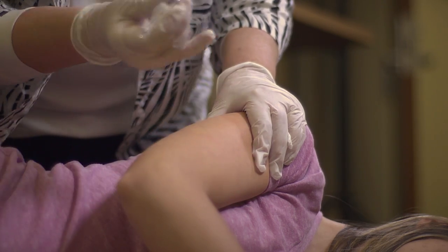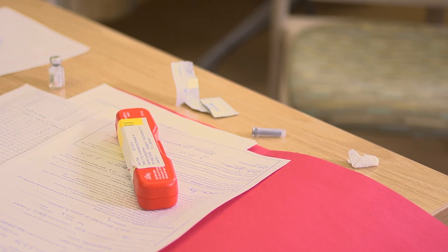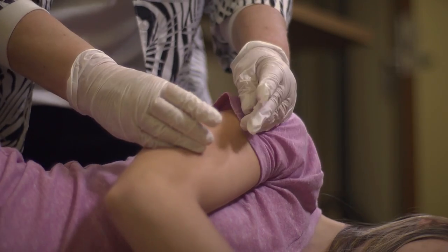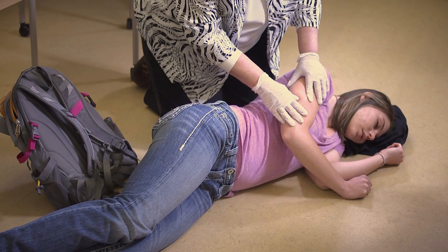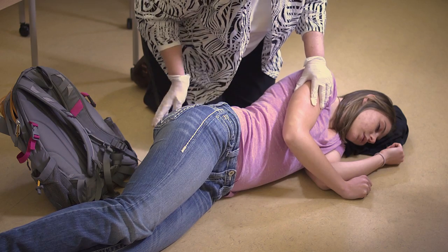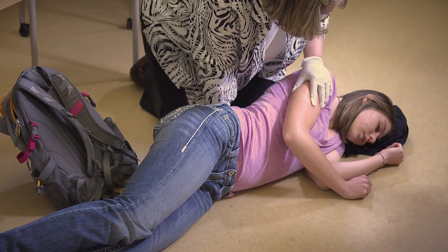Remove syringe. Put the used syringe in the carrying case. Close the carrying case to avoid a possible needle stick injury. Apply pressure using the alcohol wipe and gently massage the injection site. If the student is not lying on their side, move the student to a side-lying position because vomiting often follows the injection of glucagon. If needed, ask another person for assistance.